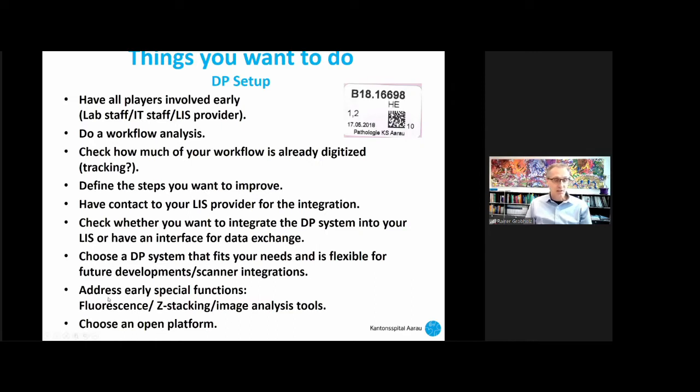Address special functions early, as we have heard earlier. Fluorescence may be a subject in your lab. What about Z-stacking? Are you using that? And image analysis tools. That's also very surprising.